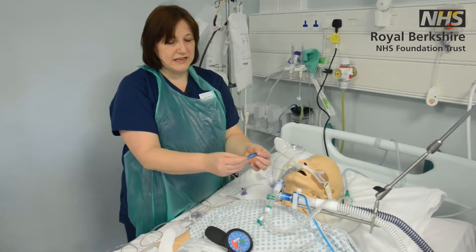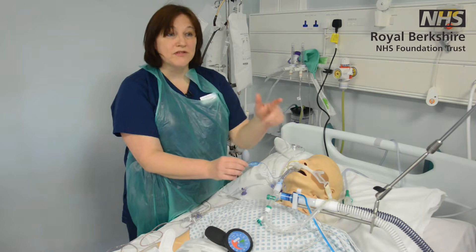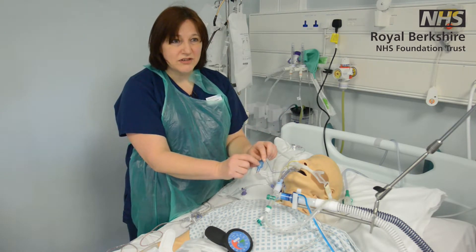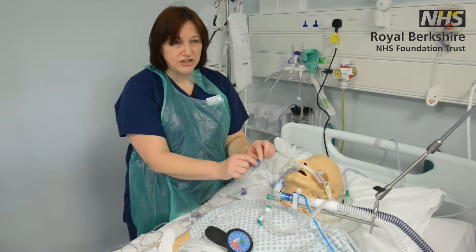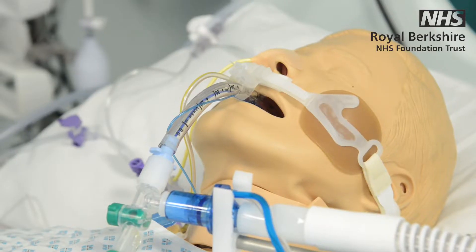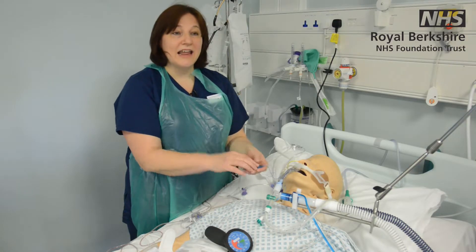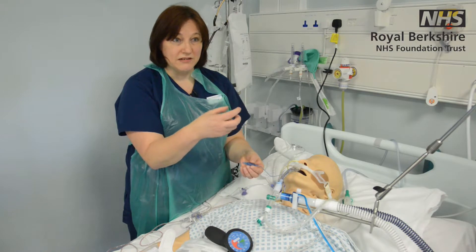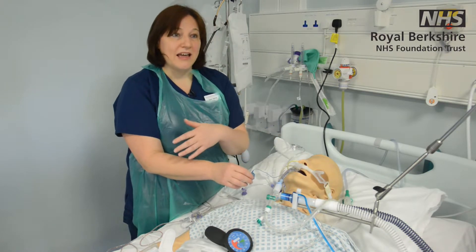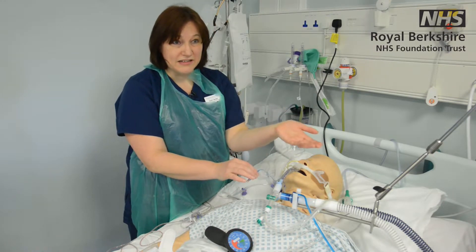On the tube you'll also see there's a cuff, and this is basically what allows us to positive-pressure ventilate the patient. On the cuff it will give you the size of the tube, or the size will be on the tube itself. The key thing about the cuff is it has air in it, and that's what keeps the positive pressure going. You don't want the air escaping — deflating the cuff means you wouldn't be able to ventilate your patient.